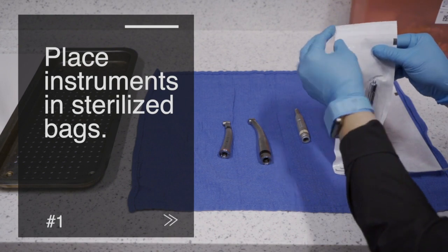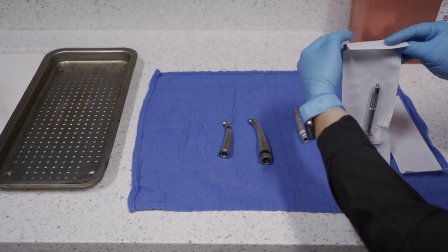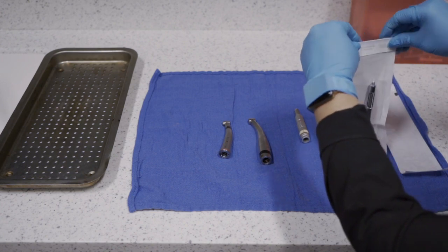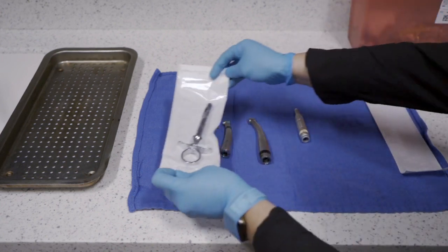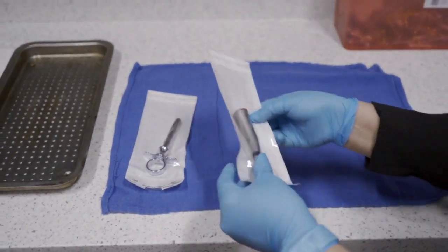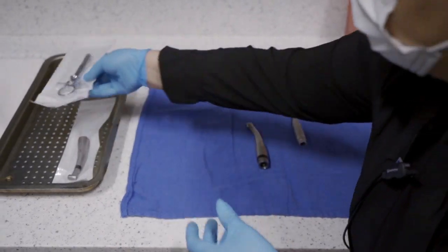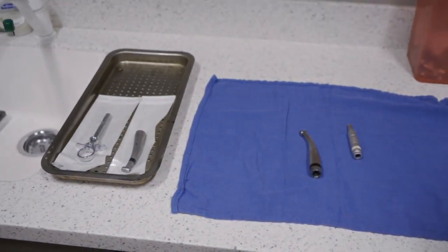Grab a sterilization bag—there are different sizes depending on what instrument you're loading. Place the instrument in the sterilization pouch and seal it at the top. Place the instruments on the tray with the open side up before placing them into the M11.